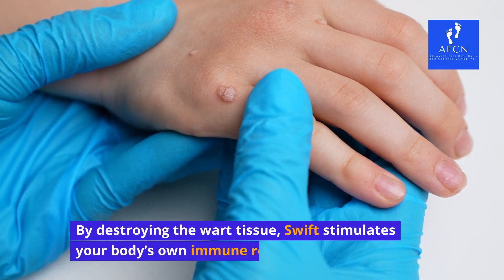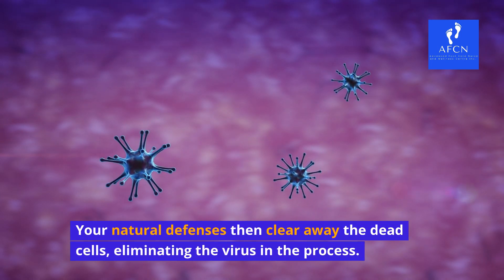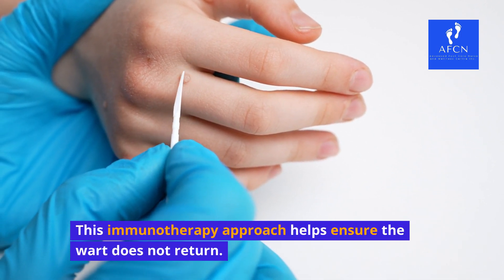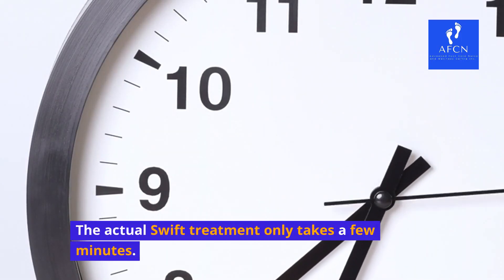By destroying the wart tissue, Swift stimulates your body's own immune response. Your natural defenses then clear away the dead cells, eliminating the virus in the process. This immunotherapy approach helps ensure the wart does not return. Studies show Swift has a 95% success rate for removing warts.